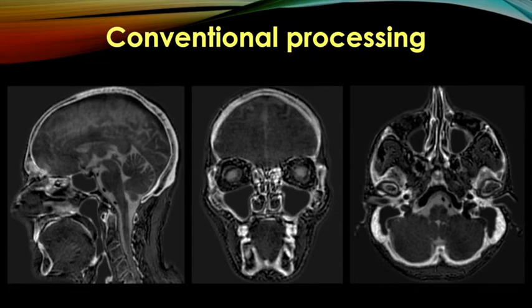And from this, you can generate 3D multiplanar reformats. So these actually look quite decent. You have the bones of the skull and face. You also see some intracranial structures, so pretty comparable to CT.